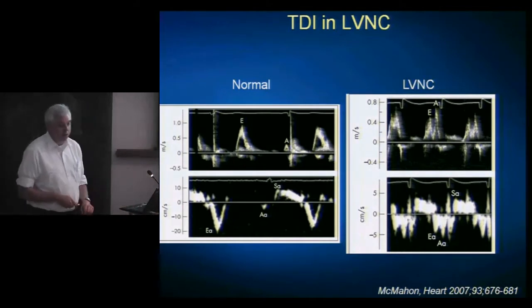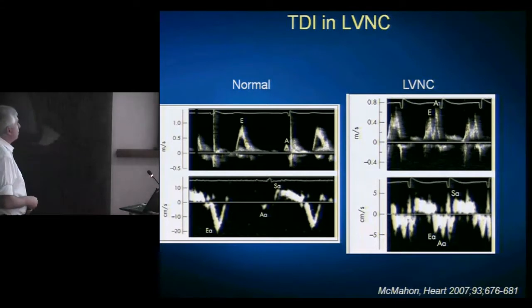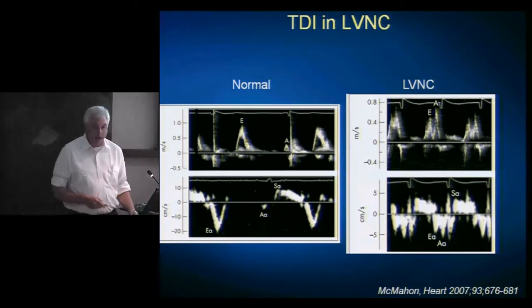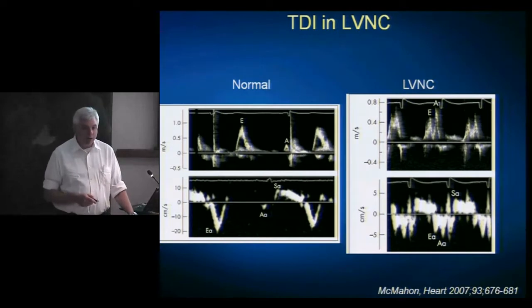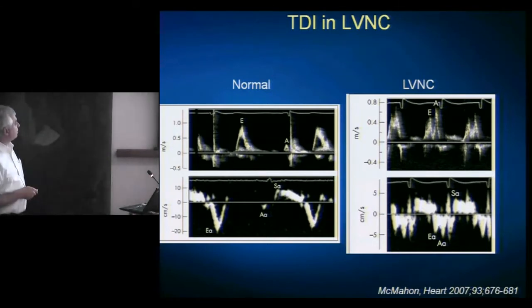analysis. Now, moving from dilated cardiomyopathy to non-compaction, I'm not going to show you a lot on non-compaction. I think it's a disease that we still don't know by echo how to diagnose well, when it is and when it isn't. Some cases are clear, some cases it's not clear. Norman has done work in this area with Raj Pan in prognostication. But just 2 slides on this, and we could have done a whole session on non-compaction.